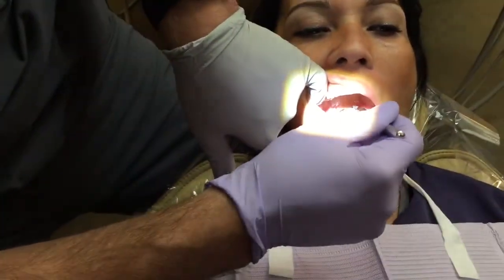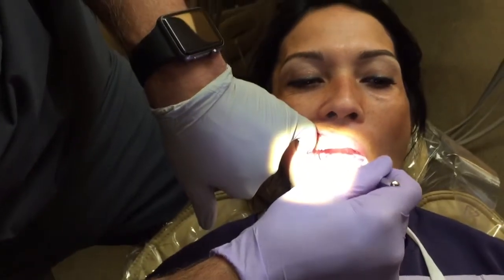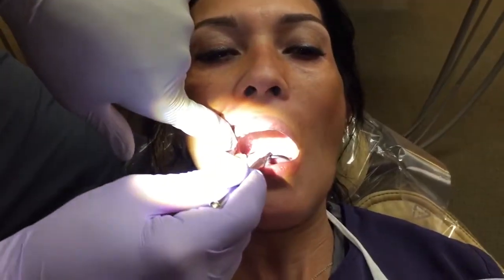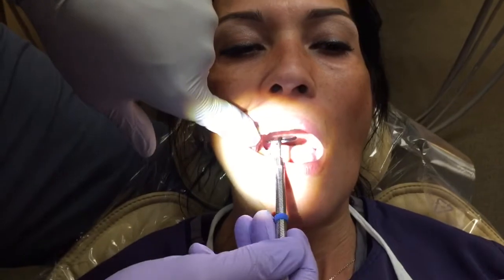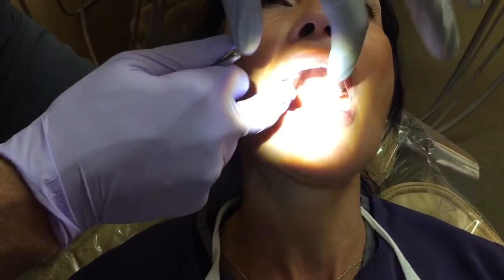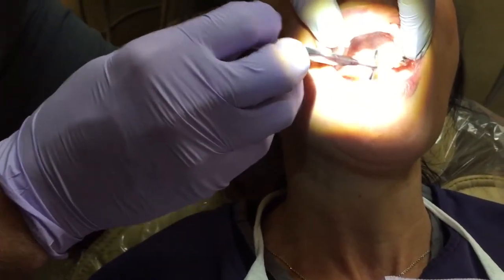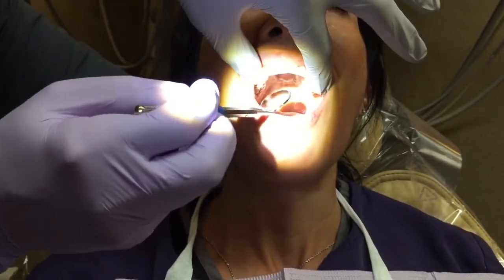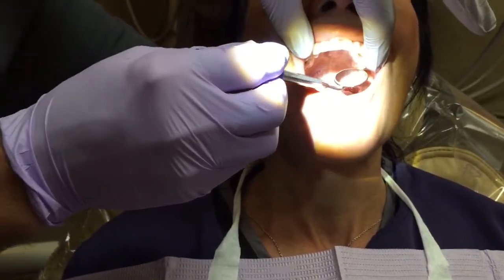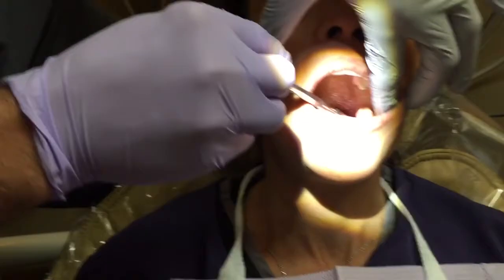Then I place my mirror in the middle of the tongue and press down to see the airway. I have the patient say 'ah' and look at the back of the throat all the way from the uvula up both sides of the soft palate, checking for asymmetry — anything on one side not on the other. I once saw a purplish hue on just one side that turned out to be cancer. Then I use my mirror at a distance to look all over the roof of the mouth, because it's easy to miss something there.